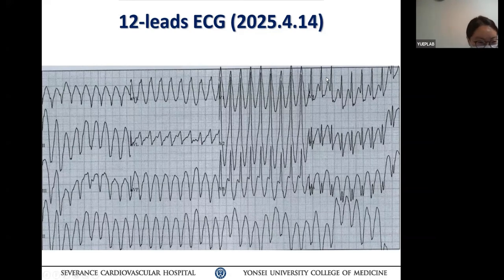This is easy, right? Okay. Now it's a regular tachycardia. Heart rate is above 250 beats per minute. Wide QRS complex. Also RBB pattern. The origin of the arrhythmia is coming from the left side, and if aVR is negative, it's making from apex to base, I think, and lead one is also negative, right?